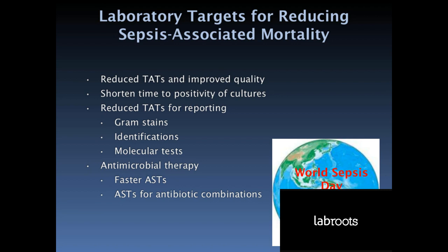It was irritating that we couldn't get all the drugs that we wanted at the right potencies. When we did the study, cefotaxime and ceftazidime were two of those drugs. I hope they're available now. I like it. I think it's worth doing. If you get an early guide to susceptibility, what drug to have the patient on, that can save lives. I think it's still developing this method, but it's got great potential. Very excited about it. Okay, thank you.